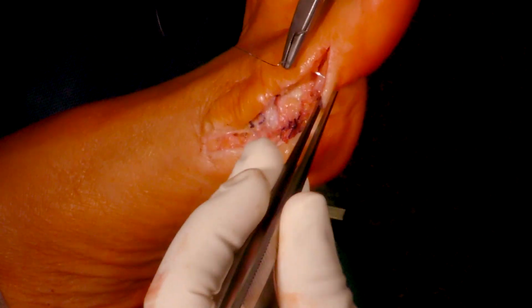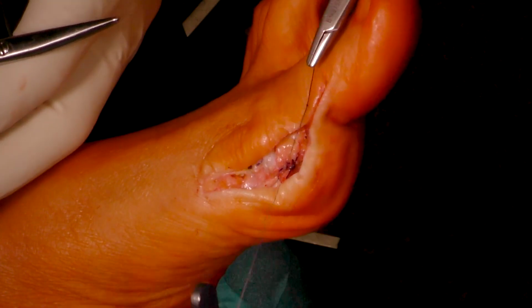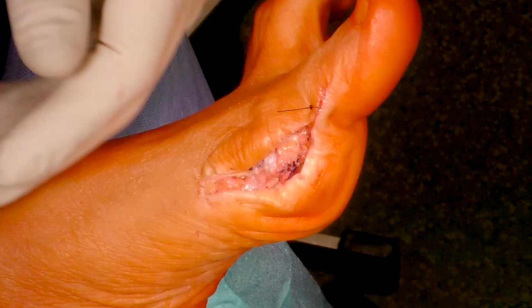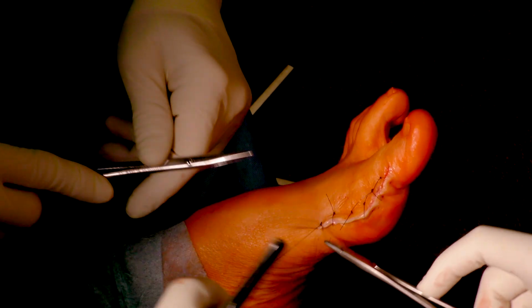Skin closure is done with single button stitches. Postoperative care.